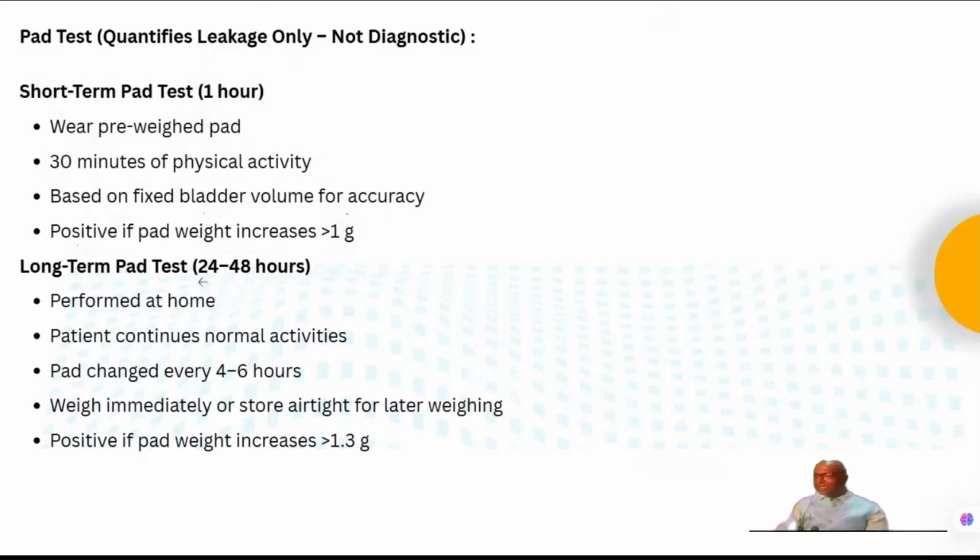The long-term pad test will be for almost 24 to 48 hours. It is performed at home. The patient continues normal activities. Okay. Here, there was 30 minutes of physical activity which was advised.